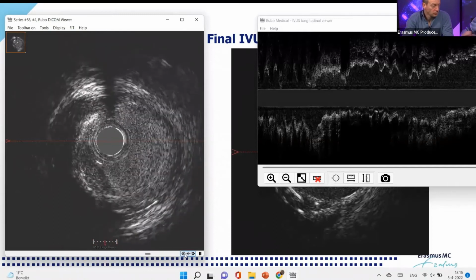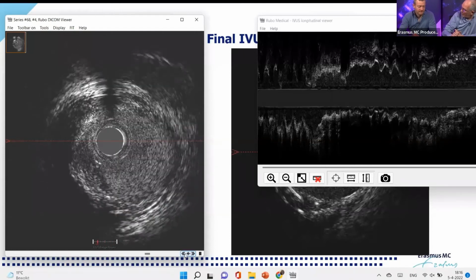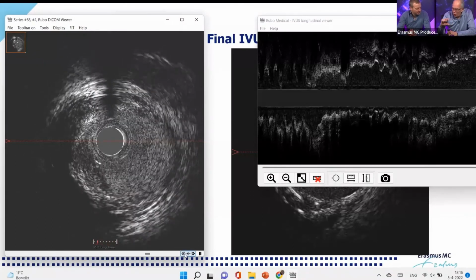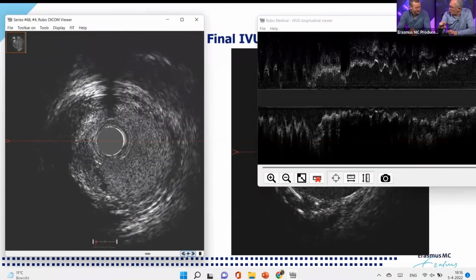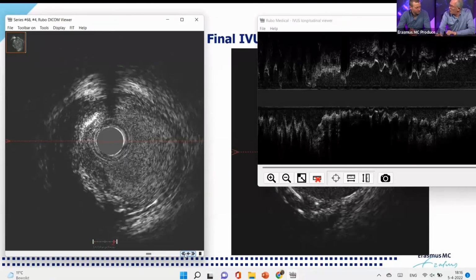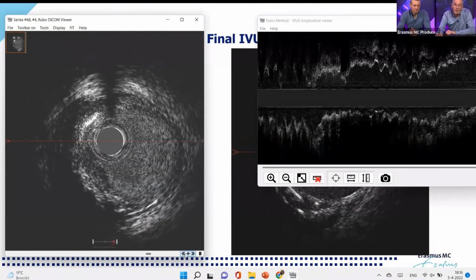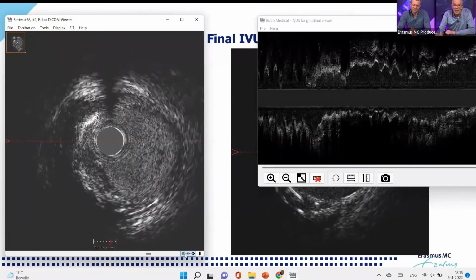Well, the fun with thrombus is, if you look at the consensus papers of IVUS, they have beautiful images for fibers and calcium. And then for thrombus, you have almost a quarter of a page that only says it could be this, it could be that, but you never can be sure. I think we tackled that in the article, and also in a book chapter where we described thrombus not only on IVUS but also on OCT.